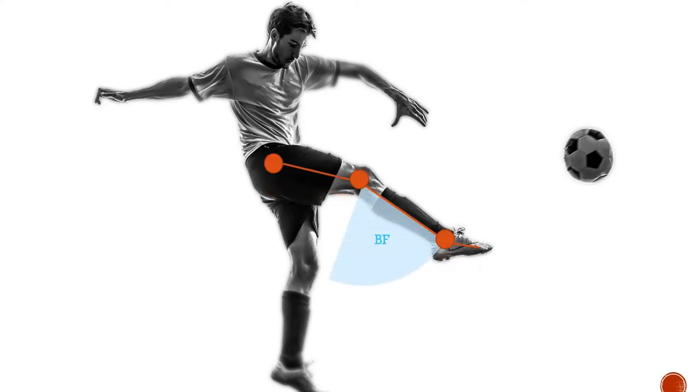But what we've been able to understand is that from 90 degrees flexion, more or less, through almost full extension, the biceps femoris tends to be engaged when we're in a position like this, where we have one limb flexed, one hip flexed and not the other.